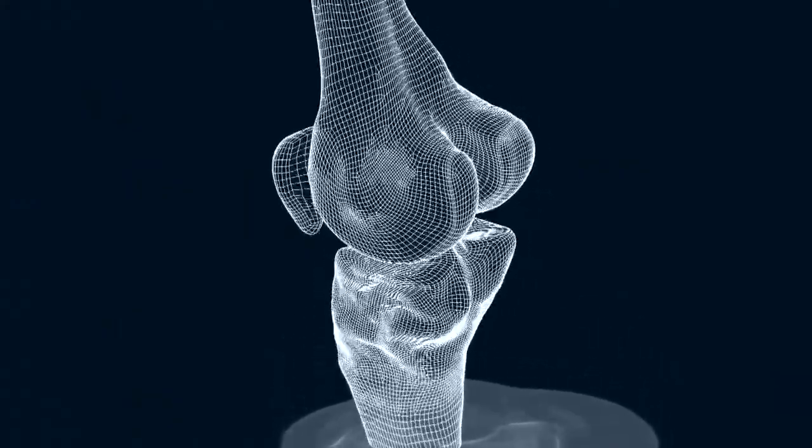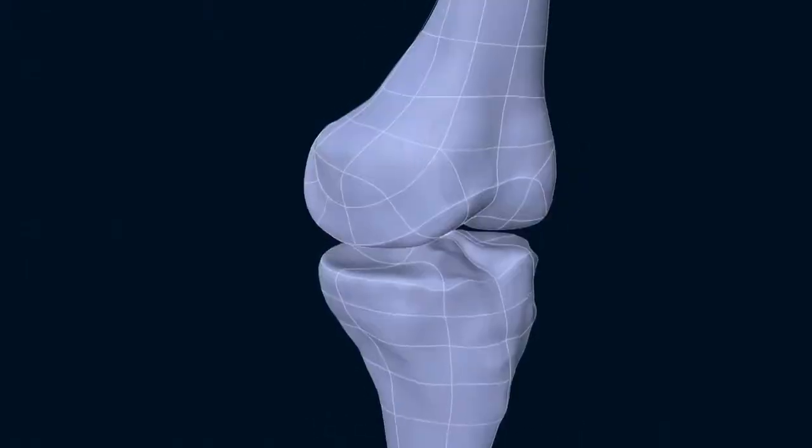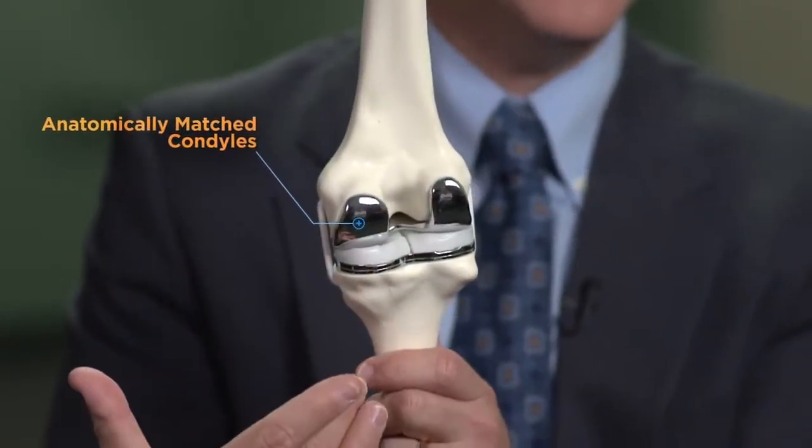Because the CT scan tells us exactly where that joint line should be, we're able to replicate it not only across the knee, but also in the inside and the outside of the knee. If you look at the condyles in the back of the knee, they're different sizes. They have to match perfectly to that patient's anatomy, which we don't see with an off-the-shelf knee.